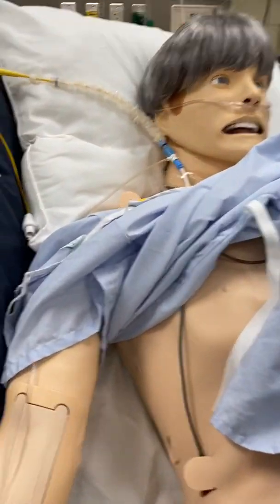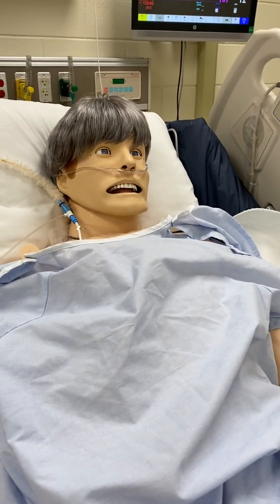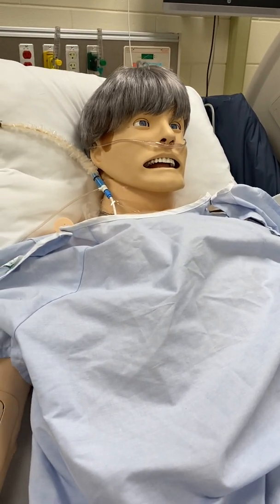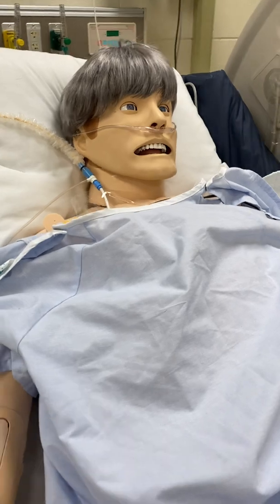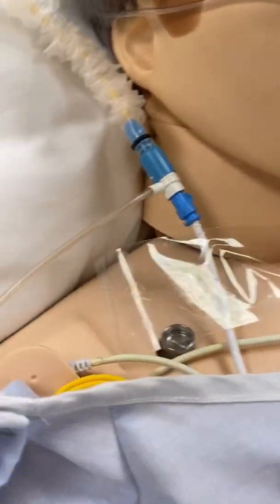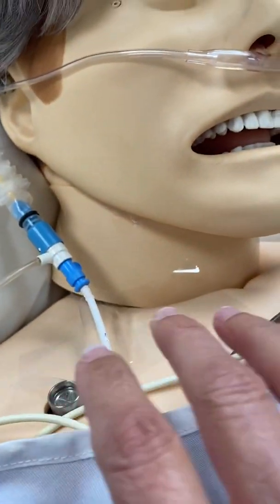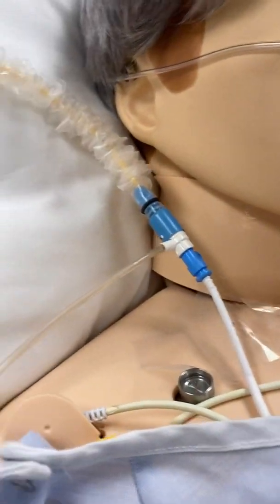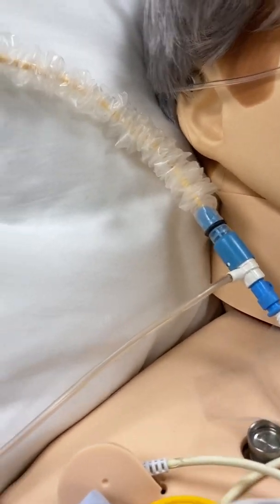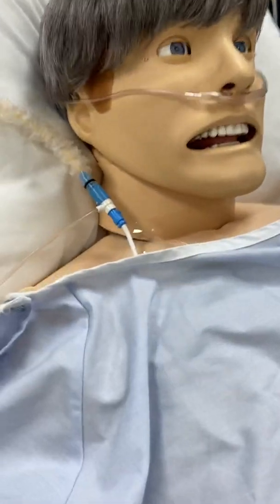Okay, guys, so meet Carl Shapiro. Many of you have already been working with Mr. Shapiro, and we're working with him in here today. So Mr. Shapiro has the Swan Ganz catheter, which, remember, goes through a central line that's already been started.